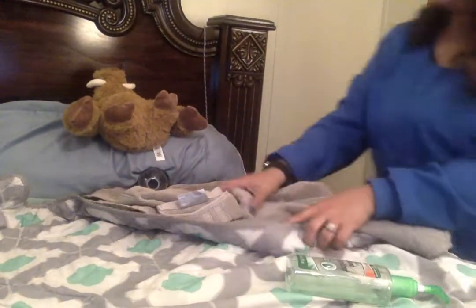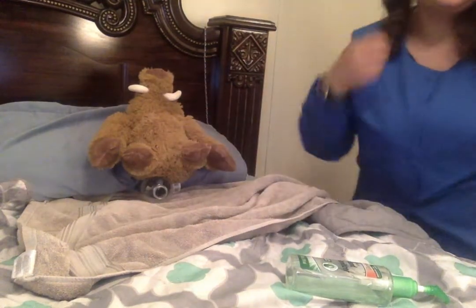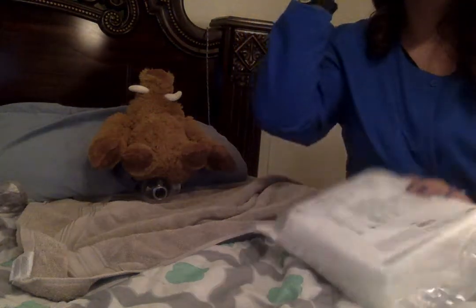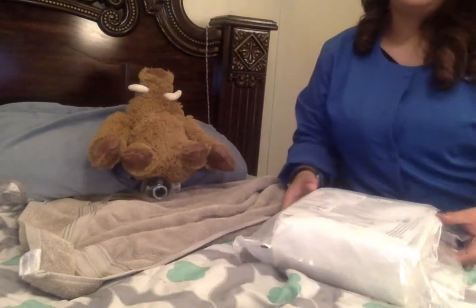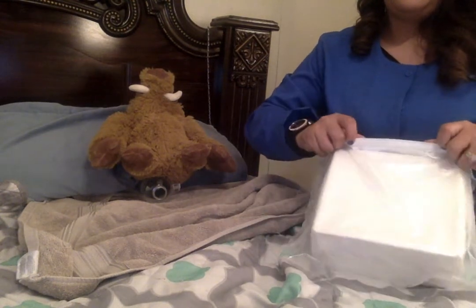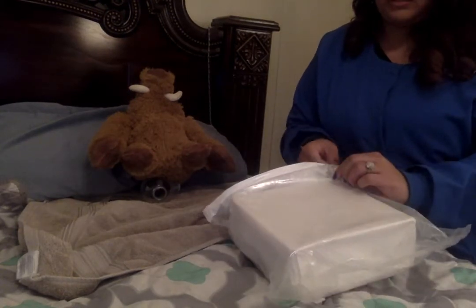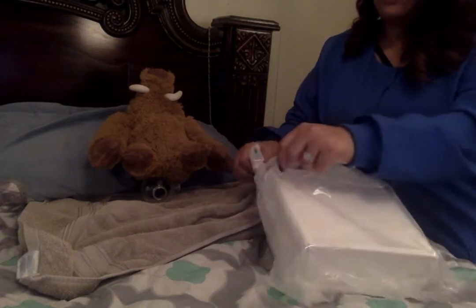I don't know if you can see this. We're going to open the outer wrapping of the kit by tearing the edge of the plastic wrap, and we're going to take the kit out of it.